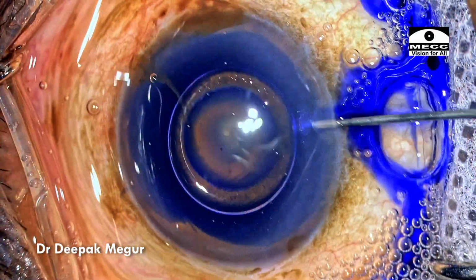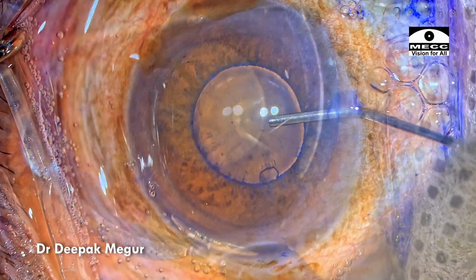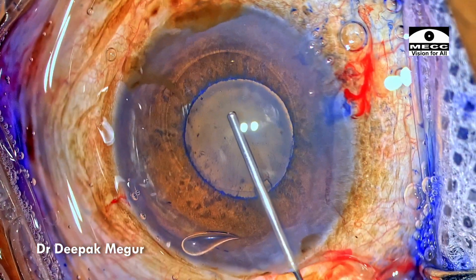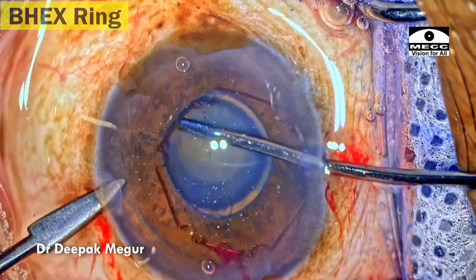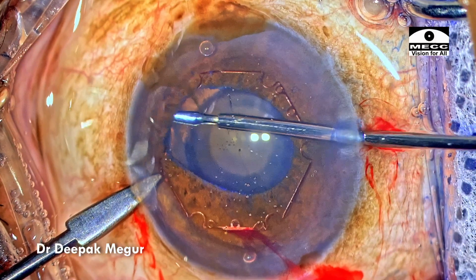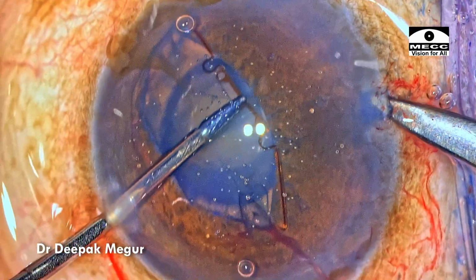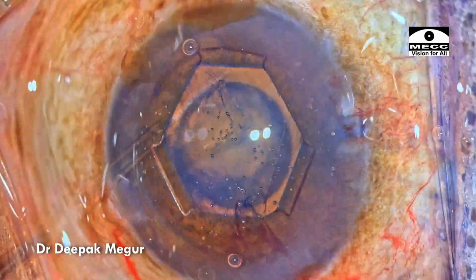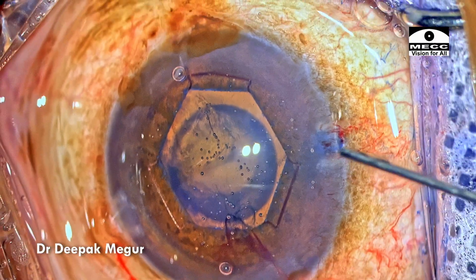So the incisions are created, the capsule is stained, and then I'm going to inject dispersive OVD to protect the corneal endothelium, and then it's time to insert the pupil expansion device, and a Bhex ring is my go-to device in most of my small pupil cases. So we have got all the notches engaging the pupillary margin, and we have got a dilatation of about 5.5 millimeter, which seems to be decent enough.